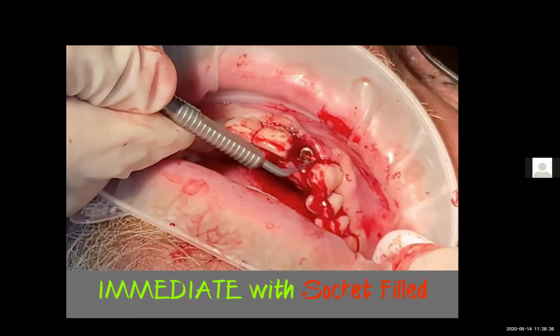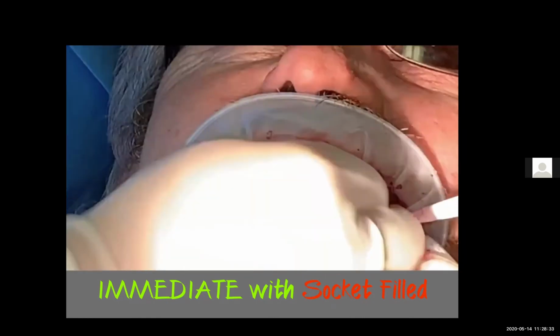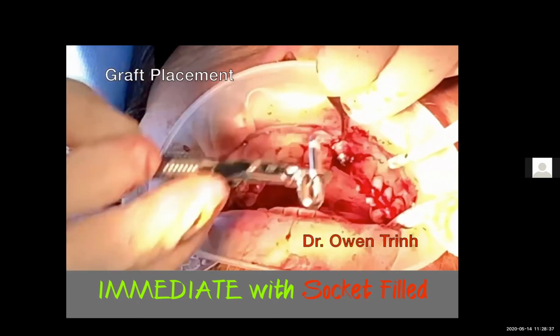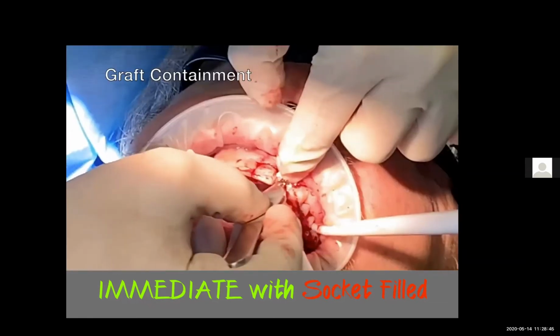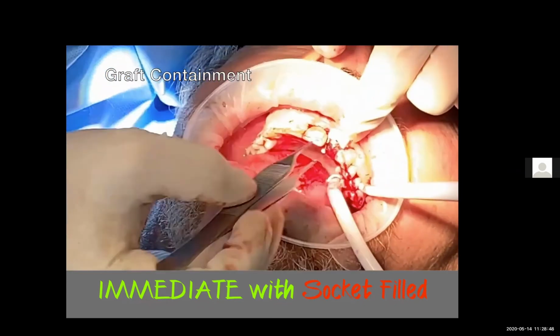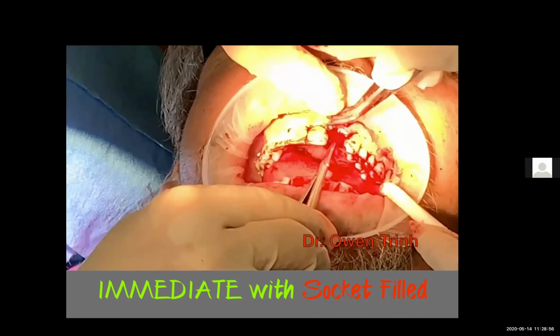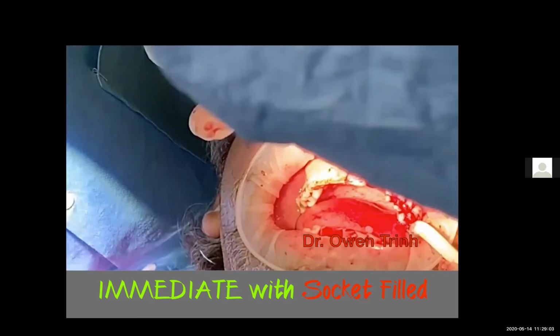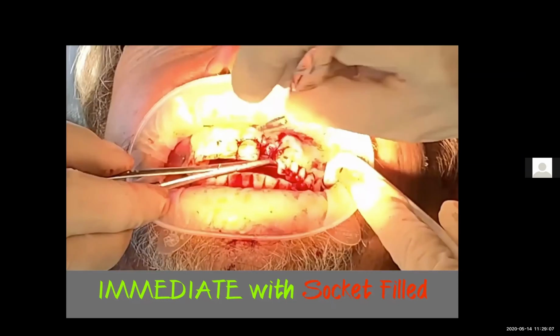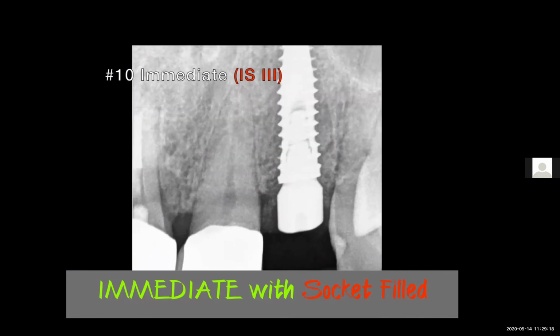And now we're ready to place graft material inside the gap. So I'm packing the bone down into the socket. And here I'm placing a resorbable membrane barrier, and I will explain to you why. And a radiograph of the final placement.